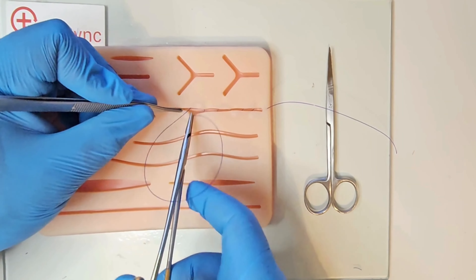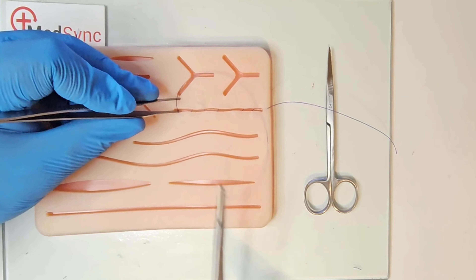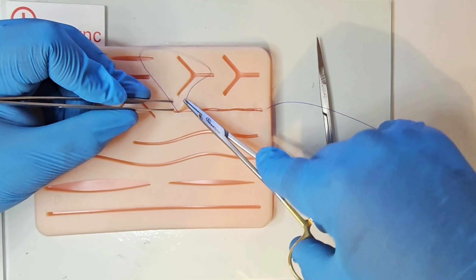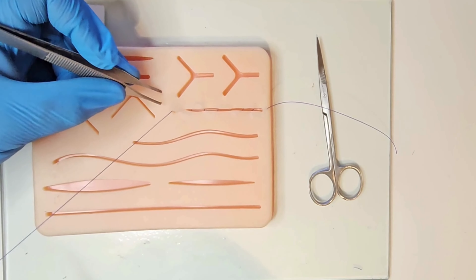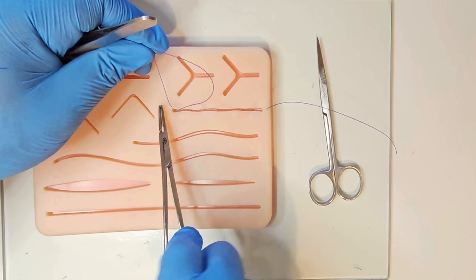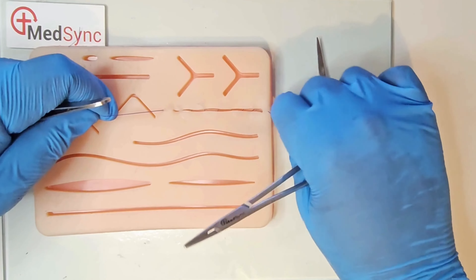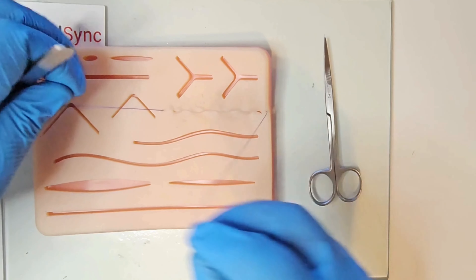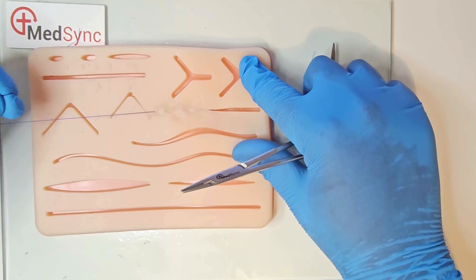Try to mount the needle early on the needle holder and minimise overhandling of the needle between bites. You exit through the apex and can pull both ends of the suture until the wound closes. For a pull-through suture, use a monofilament suture that you can simply pull out once the wound has healed.